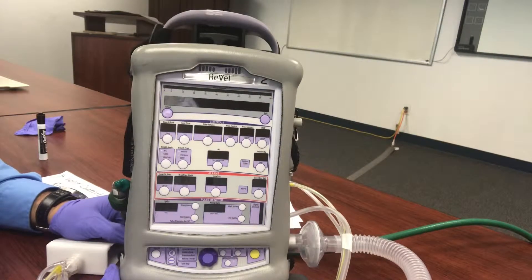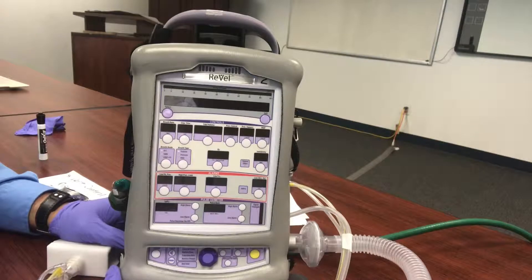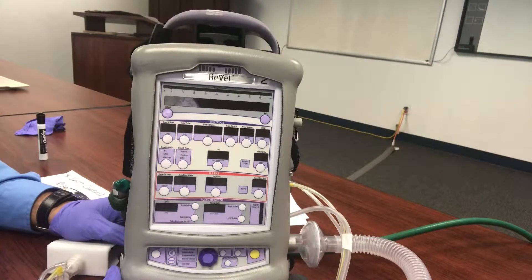We have a Revell travel ventilator and we're going to use it as a BiPAP or NPPV, which is non-invasive positive pressure ventilation. This is for your patients who aren't intubated, and we're going to use this as kind of a CPAP/BiPAP modality just to get them there.